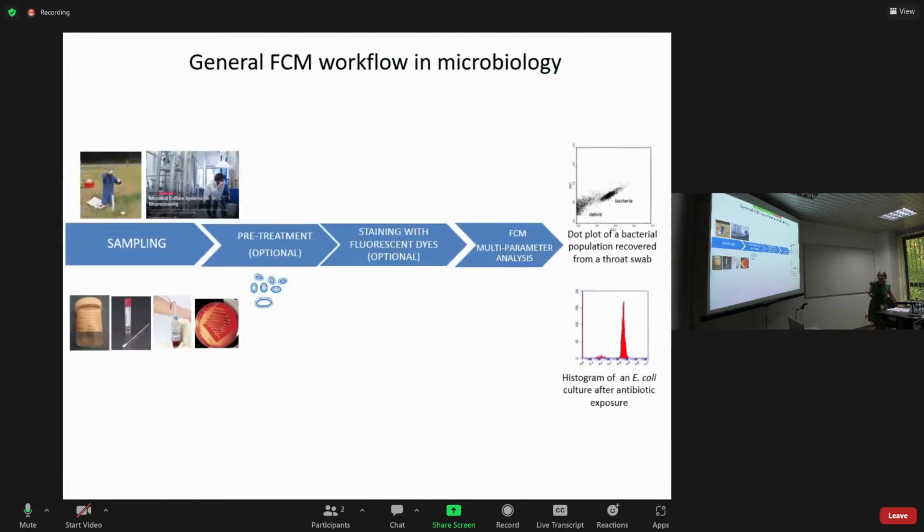And the principle would be sampling, and we are intending to standardize the methods to detect directly in clinical samples, and not after we have isolated the strains, because this isolation requires at least 10 hours. And then the pre-treatment, because we are talking about very complex biological matrices here that could influence the results.